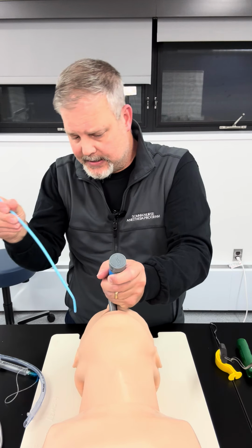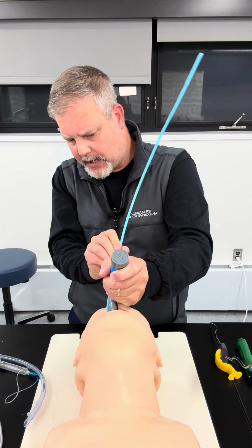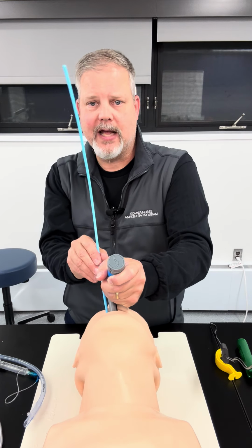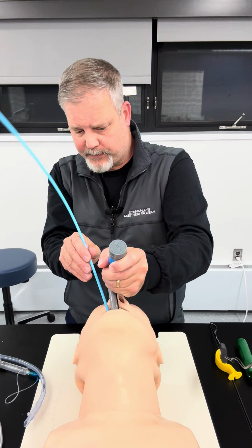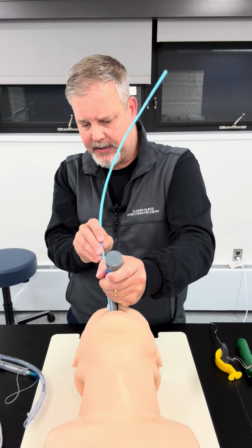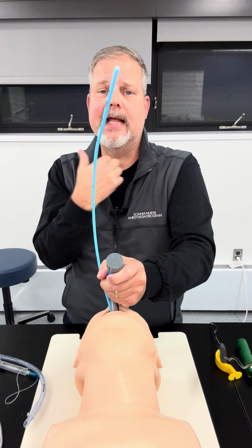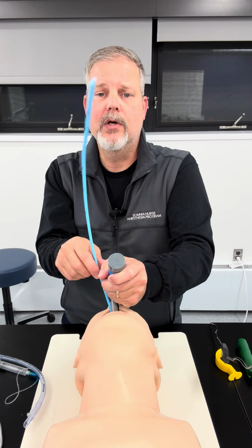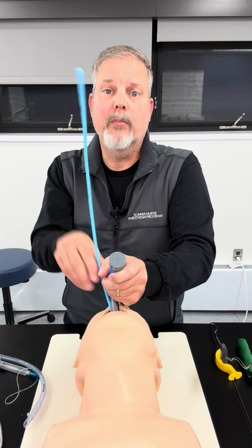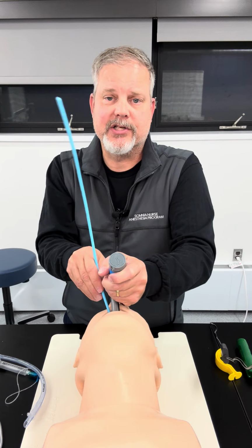What I'm going to do now is insert this into the oral airway, and then insert it into the area where I said I saw my vocal cords. Now, as it's going through the trachea, I should feel it bumping. That's the reason for the curvature: the tracheal rings on the anterior portion of the trachea. I should feel the curved part bumping across those rings, and that helps confirm that you're actually in the trachea.